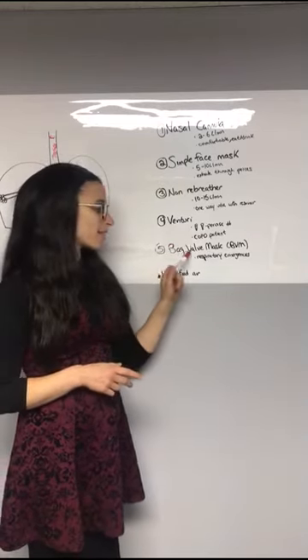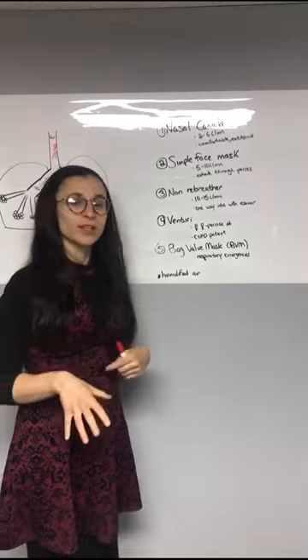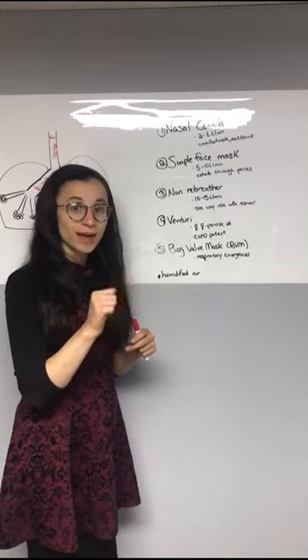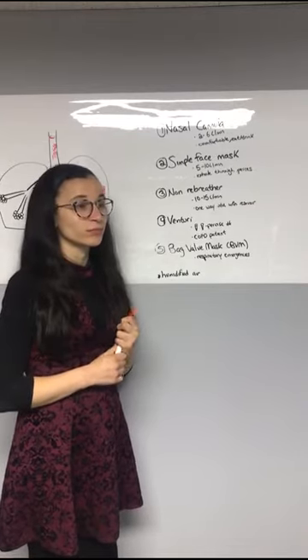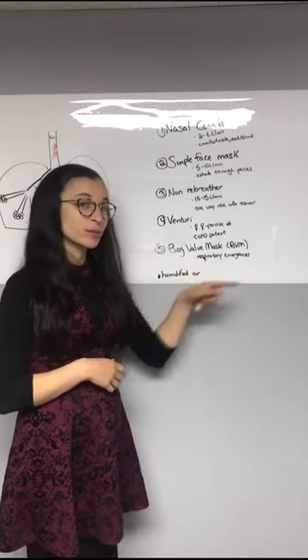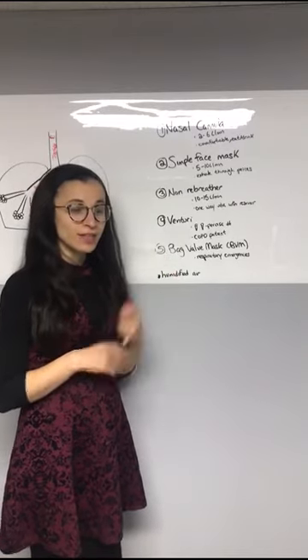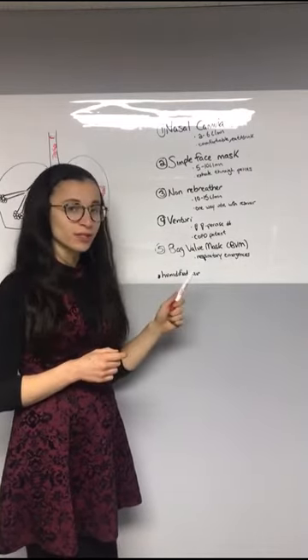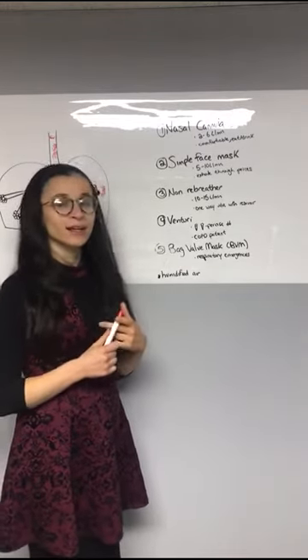The next one is a bag valve mask, BVM. You'll probably see it in the movies with EMS, where all of a sudden someone's not breathing and they're pressing it, you know? You squeeze the bag and it forces air into the patient's lungs. So it's for someone who is not breathing themselves. This is for respiratory emergencies. If you're bagging them and they still don't have it, you're going to put an endotracheal tube down. Well, these are not long-term options. They're short-term, if someone comes in hypoxic or someone needs a little more oxygen, like an asthmatic, etc.